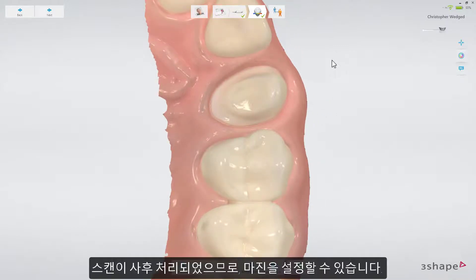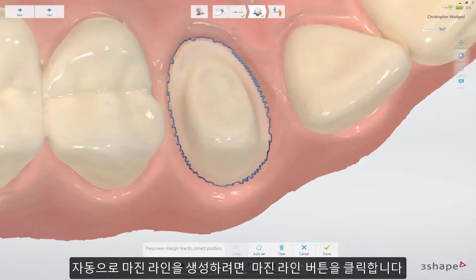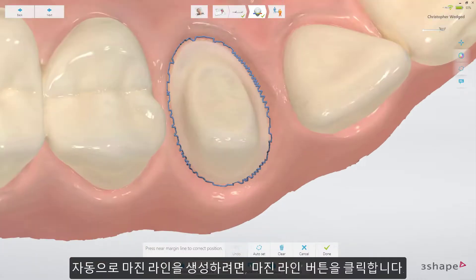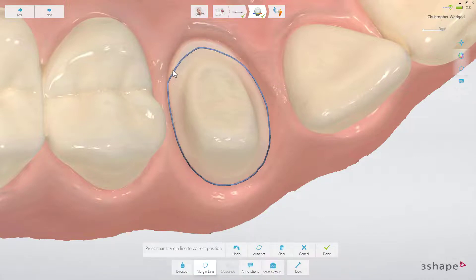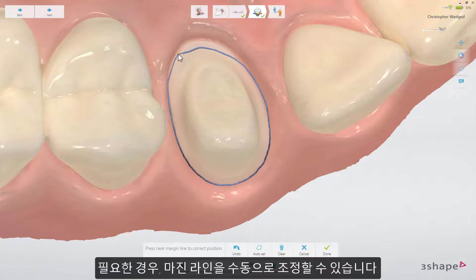Now that the scan has been post-processed, you can place the margin. In order to create a margin line automatically, press the margin line button. If necessary, the margin line can be adjusted manually.